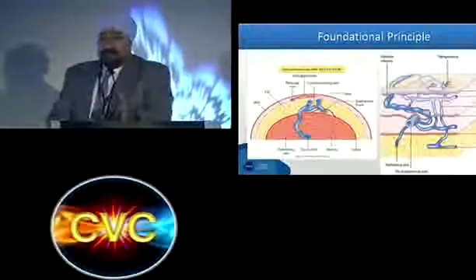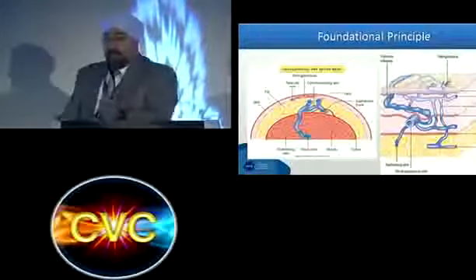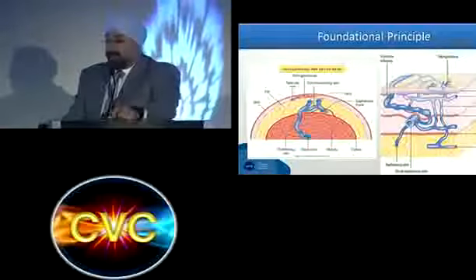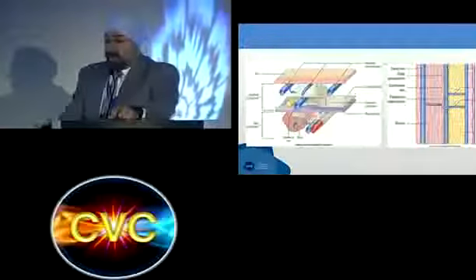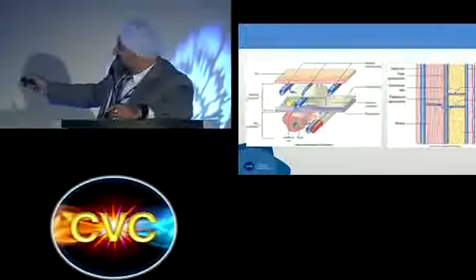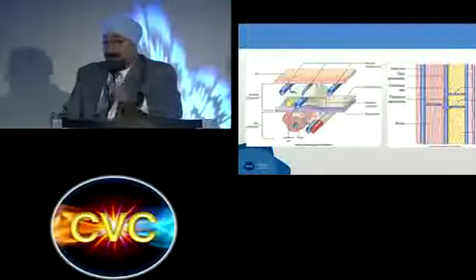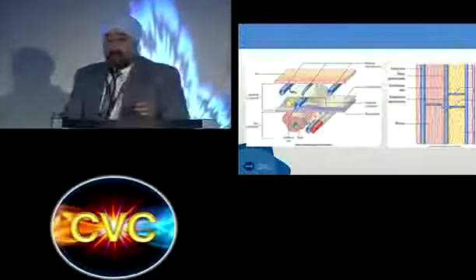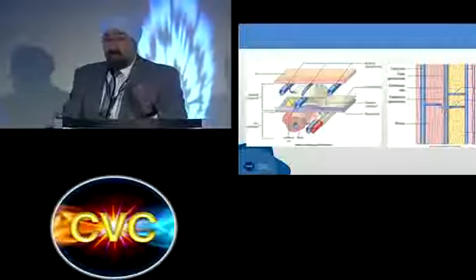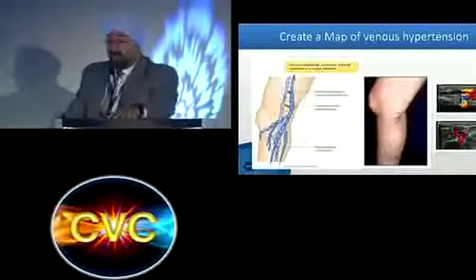Oftentimes, the ones that connect into the saphenous, lesser or greater, if you treat that whole pipe, the rest of it will shut down. So I'm going to try and show you the ones that are isolated. Kind of understanding that a lot of the perfs will have an artery close to it, especially as you get closer down to the leg, posterior tibial. But you can see perforators in the lateral side of the thigh, medial thigh, below the knee, ankle, foot, depending on where the pressure is coming from.